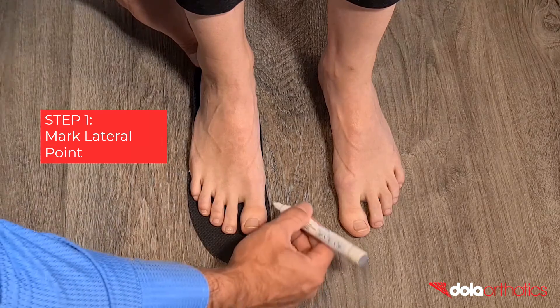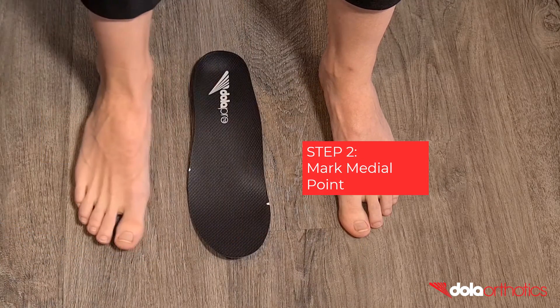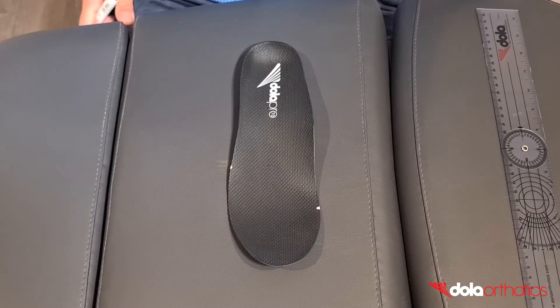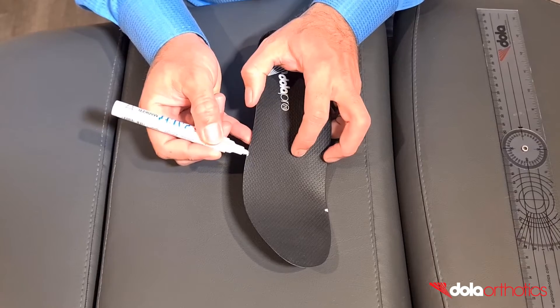Step 1: Mark the lateral side of the gait plate. This will commonly be just proximal to the 5th MPJ. Step 2: Mark the medial side of the gait plate. For an out-toeing gait plate, this will most commonly be a position forward of the 1st MPJ, in this case at the sulcus of the hallux.